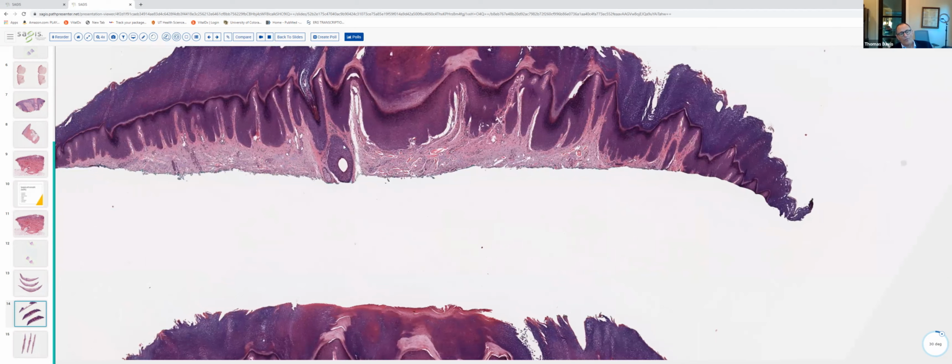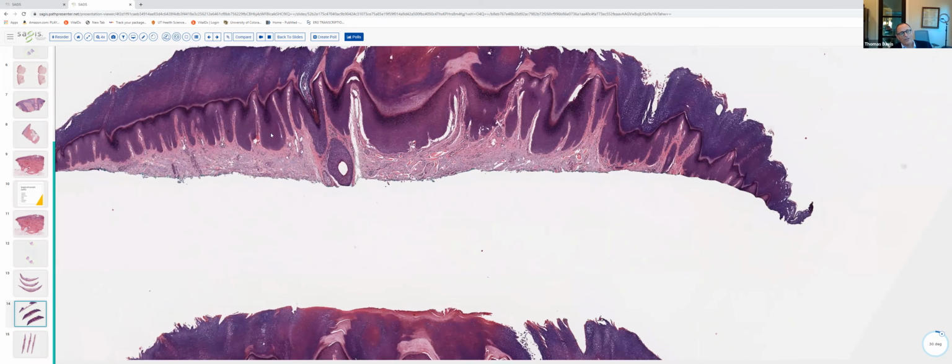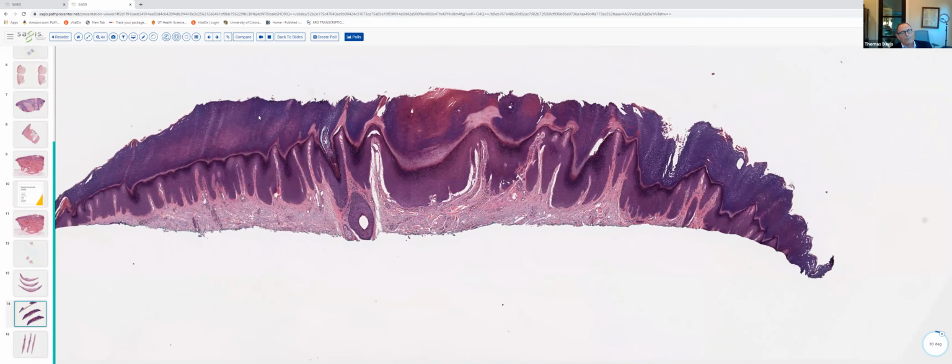That is hair bearing. We've got a hair follicle and a sebaceous gland here. But if we look at the cornified layer, it's got a cornified layer like stratum corneum, like a volar surface, palm or sole. And we know we don't have hairs on the palm or sole, and so we've got our hairy palm sign.